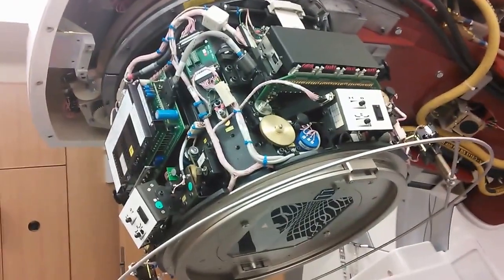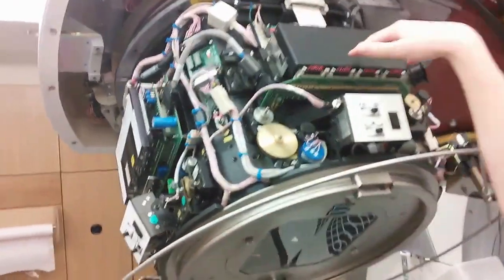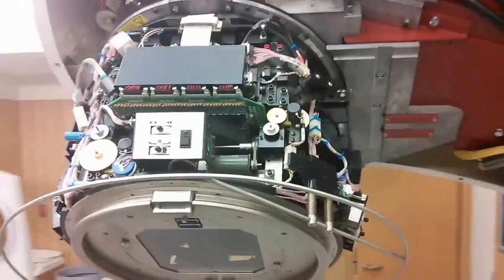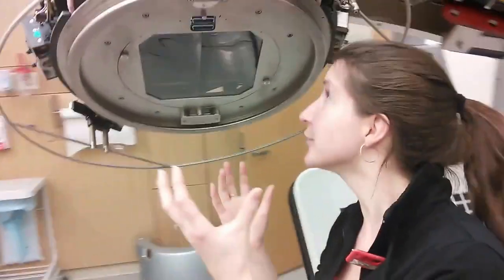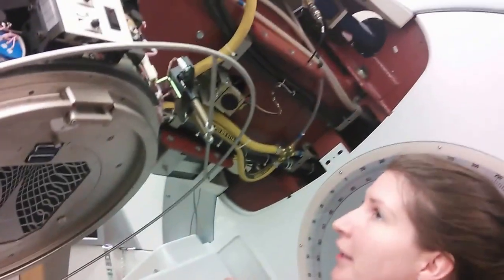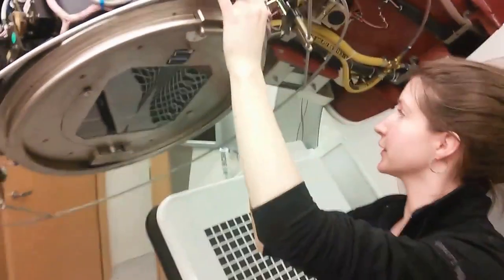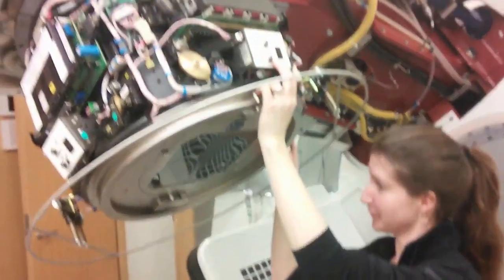So this is the head of the LINAC and right now we have it apart for a PM. In here is where the leaves are. We have a multi-leaf collimator that can move into intermediate positions in order to create field sizes for cancer treatment. And we have diaphragms behind that. So these are the controls for the collimator diaphragms.